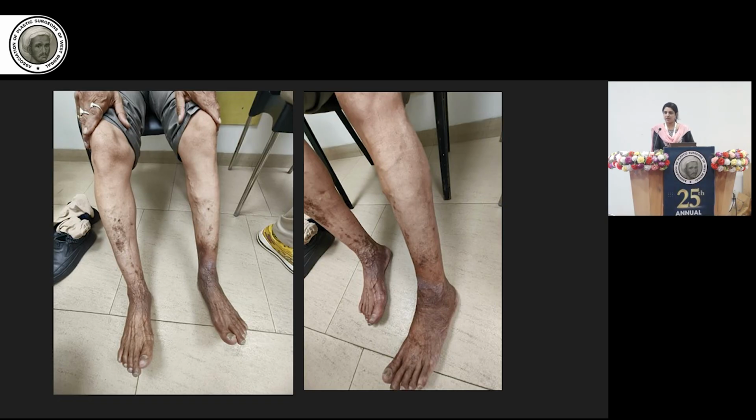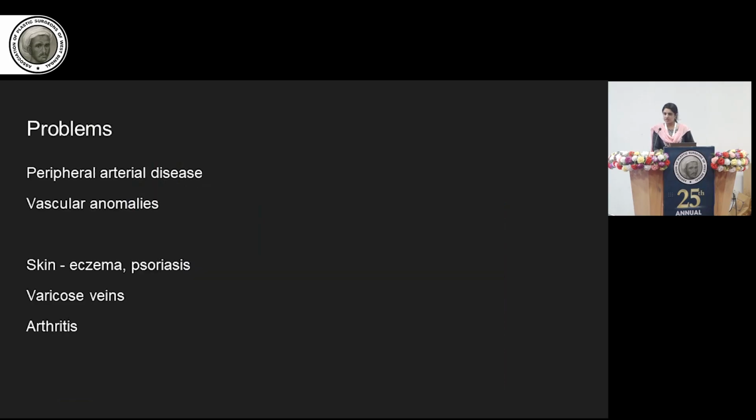So luckily we work in an institute where most of the mandibular and maxillary reconstructions are done in a planned manner, and we get an opportunity to assess the patients preoperatively in the OPD. Now, we have a waiting period of a few days during which we assess the patients and plan what kind of reconstruction would be best for them. So we get an opportunity to assess them for peripheral vascular diseases, any skin changes, arthritis, etc., because these patients are of a certain age group.